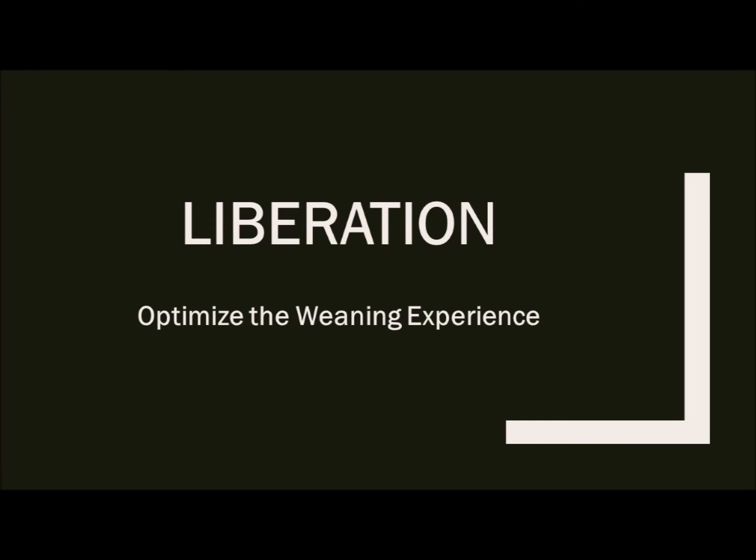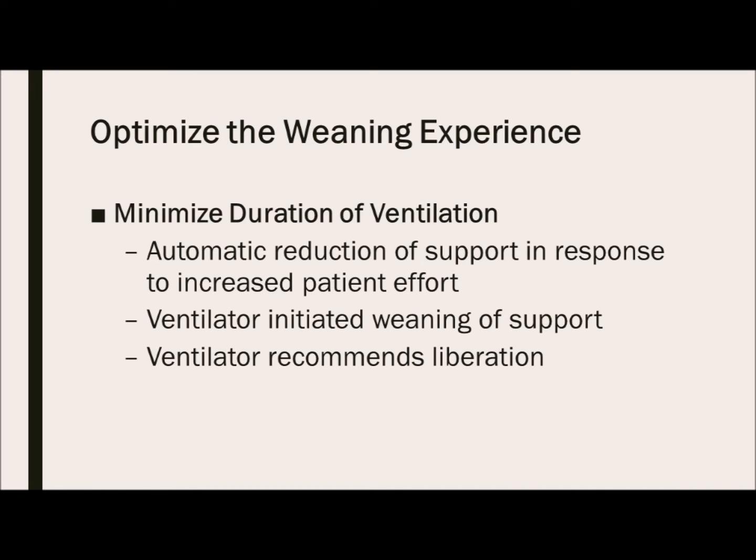Regarding the third goal, liberation, can we optimize the weaning experience? Does your mode provide an automatic reduction in support in response to increased patient effort? Does it allow for a ventilator-initiated weaning of support? And does the ventilator recommend liberation?